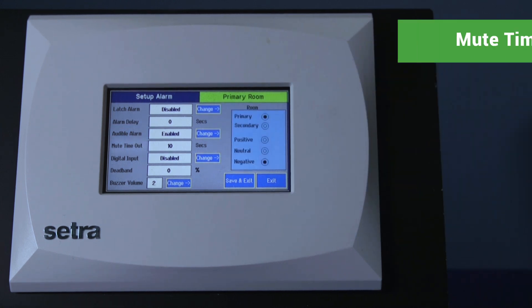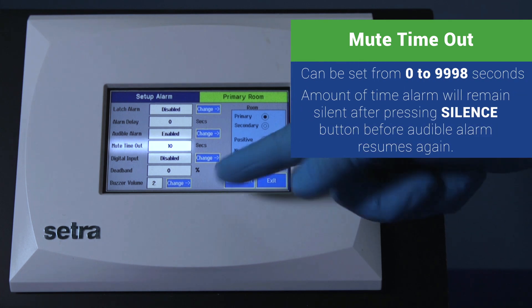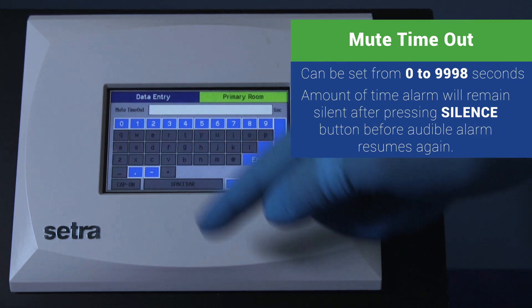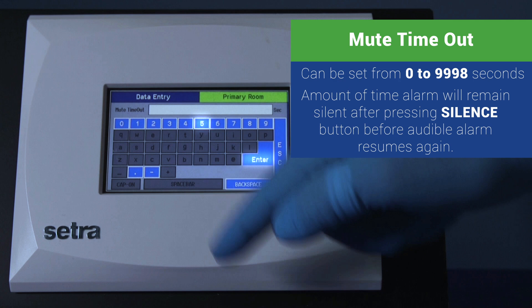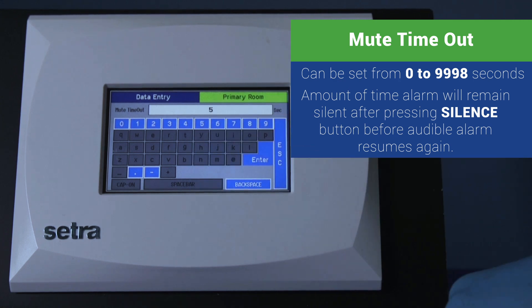Mute timeout is the time in seconds that the alarm will remain silent after pressing the silence button before the audible alarm resumes again.